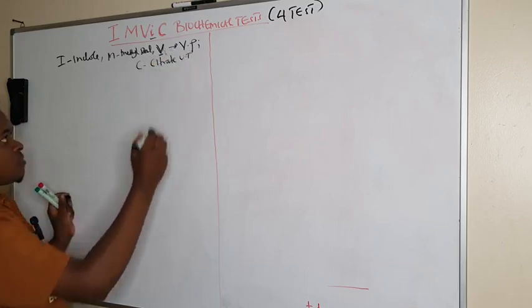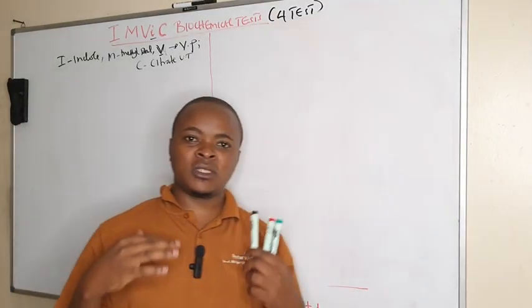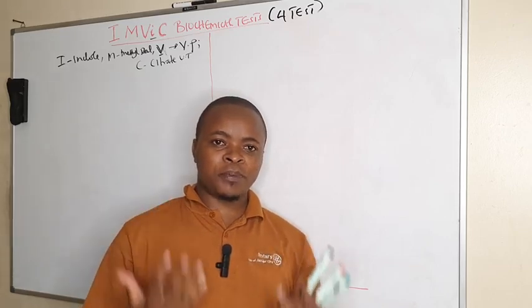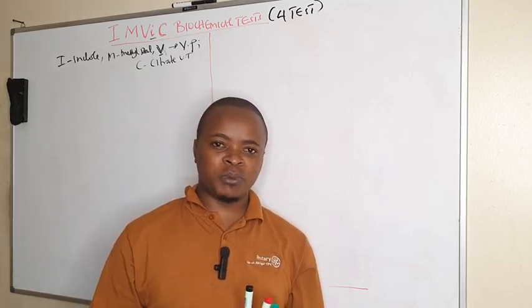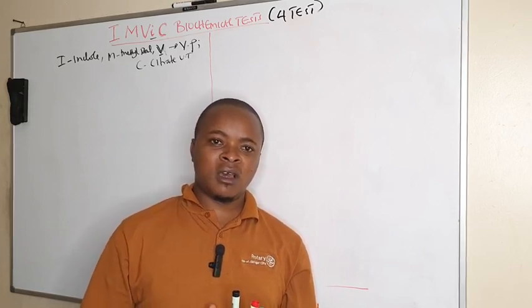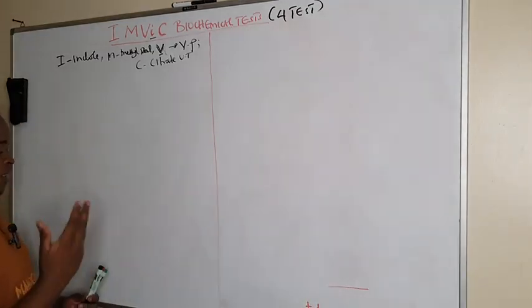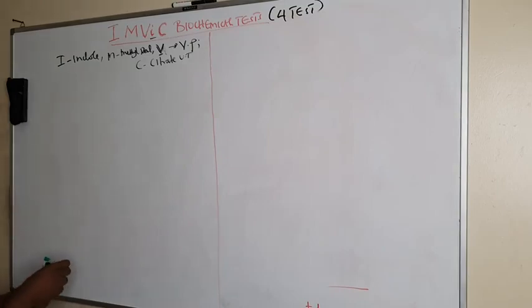utilization tests. So in this video we are going to see briefly the principles of these tests and which organisms they identify when they are positive. And without wasting time, we want to begin with Indole.